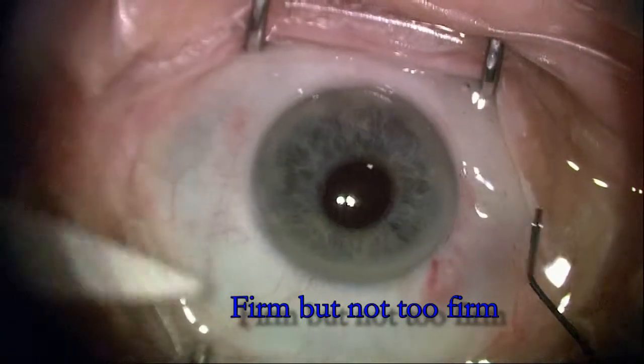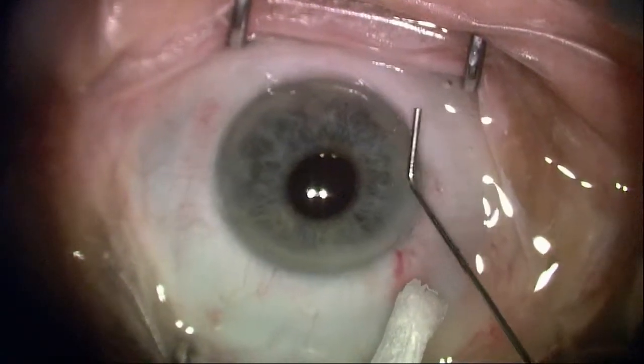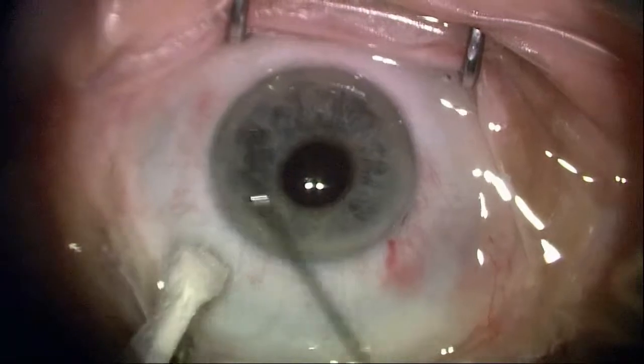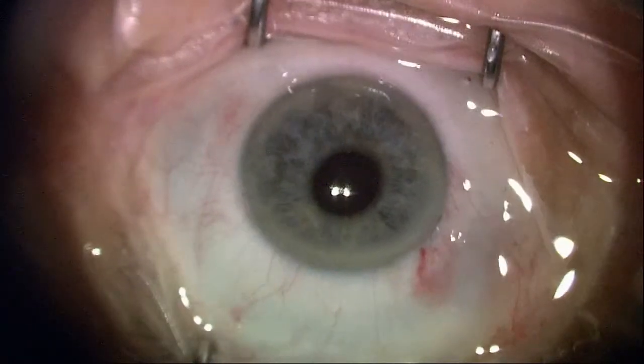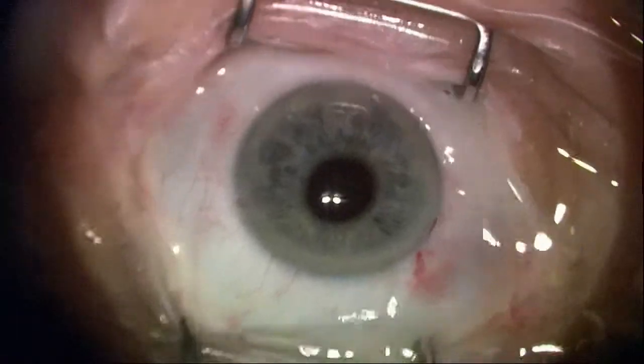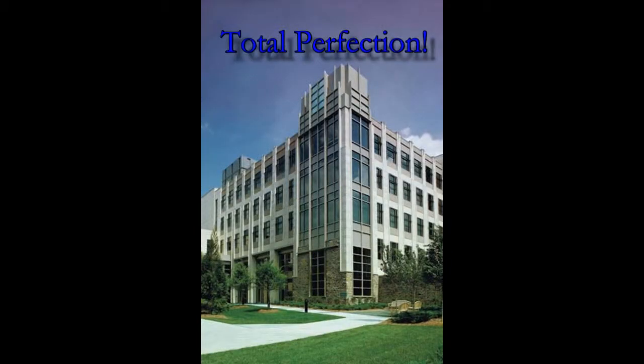You want it kind of firm, but not too firm. You want to make sure it's firm so that you don't have an opportunity for inward migration of fluid or a one-way valve inward. That completes a very nice procedure. The patient's done extremely well. Thank you.